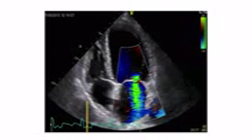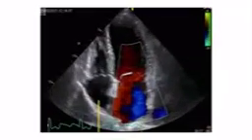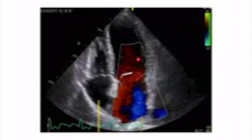With echocardiography and with visualizing the jet, we can get a lot of information. I'm freezing the image now during systole, and right at that instant, we have mitral regurgitation. You see the jet right here from the left ventricle into the left atrium during systole. So what else should it be? It must be mitral regurgitation. If you freeze during diastole, right here, we have no jet. We have a little bit of inflow, red color here right into the left ventricle, but definitely no regurgitation.